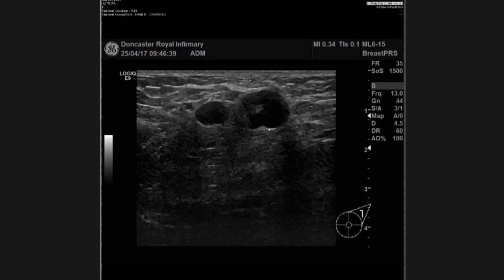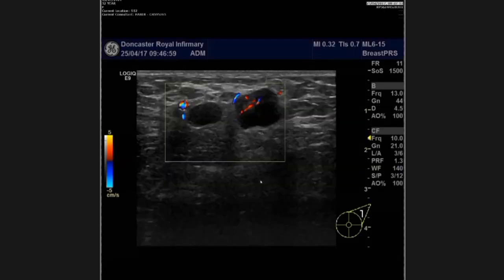I'm able to appreciate enlarged lymph nodes, with slight disruption of the cortex and medulla, increased cortical thickening, and peripheral blood flow, which again is a sinister sign in this case. So these might represent disease spread in this region. These appear to be suspicious nodes. Suspicion of malignancy is there in these nodes, so this confirms my findings. So this is likely BI-RADS 4C.